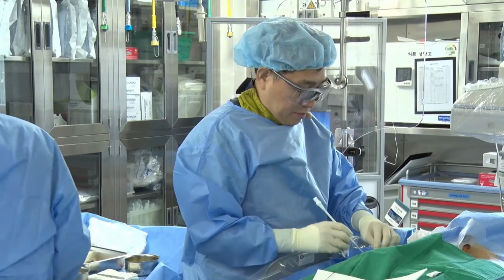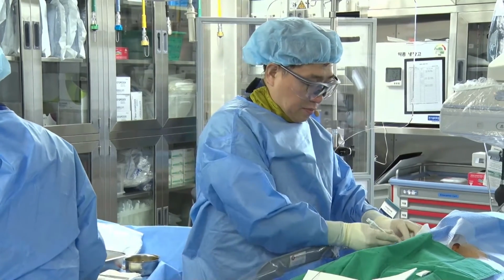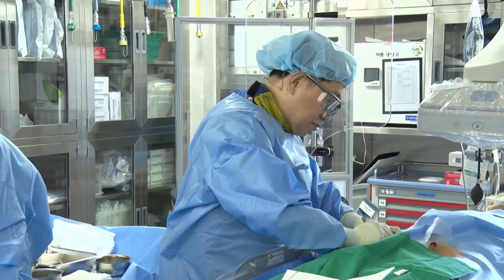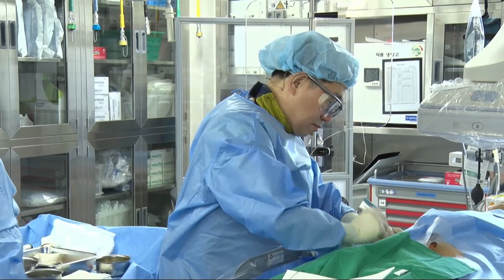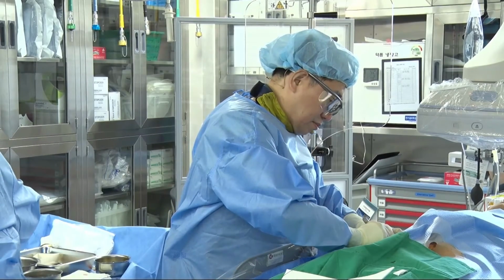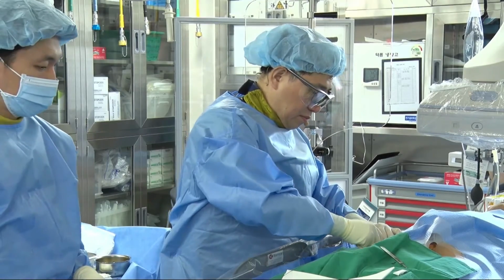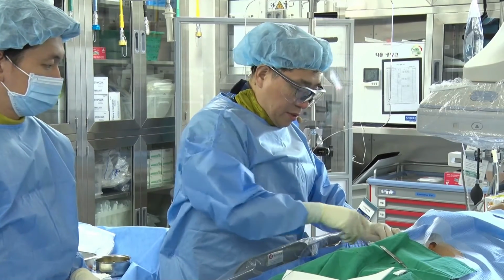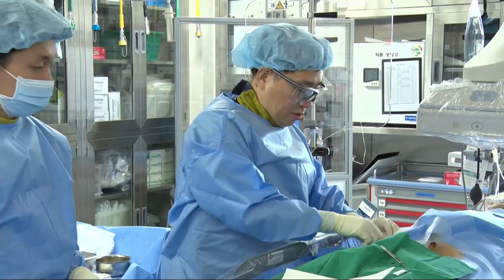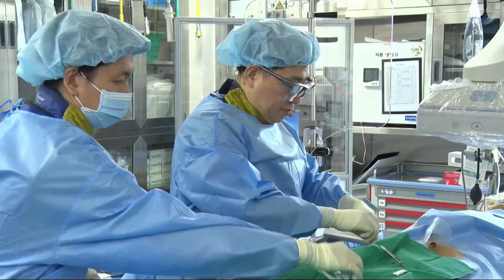But to make sure, this sheath is very tough, especially the dilator is very tough. So make an incision and push the sheath gently and slowly. And when you push the sheath, you can try to move the guide wire freely and check it repeatedly. If the guide wire is bent and you cannot move it freely, that means your sheath may be stuck to the venous wall. If you push more, probably you will make a disaster.